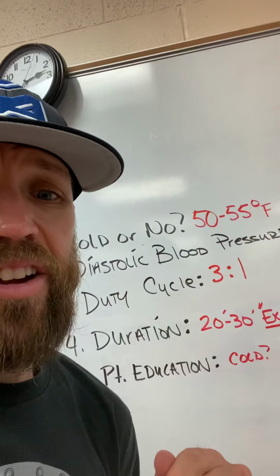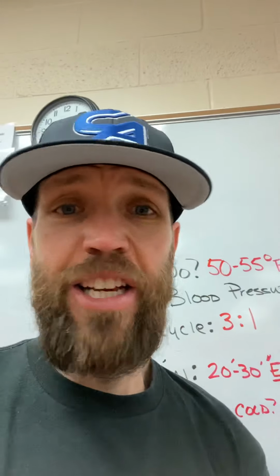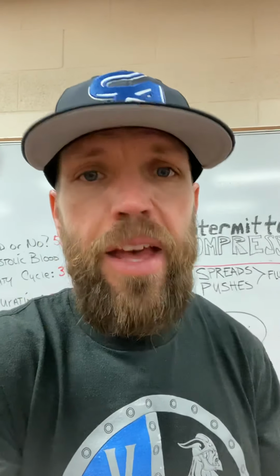And then the last thing here is always patient education. Tell the patient, listen, this is going to get cold, or maybe, hey, listen, this is going to squeeze. Why do they need to know that? Because patients don't know that. Patients always deserve your top priority to be educating them on what they're going to experience.